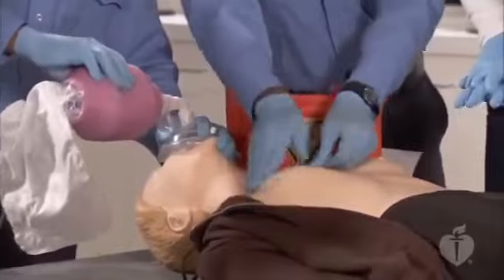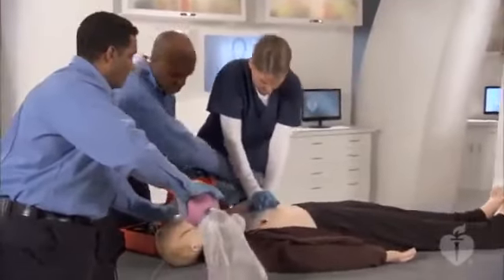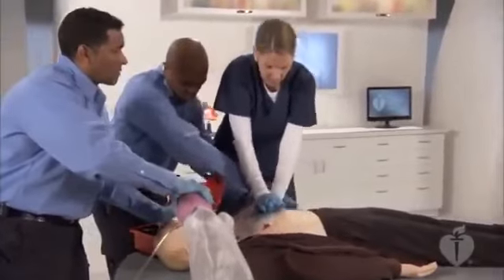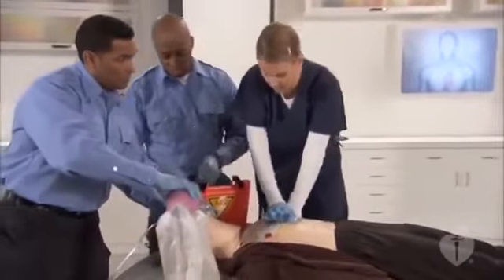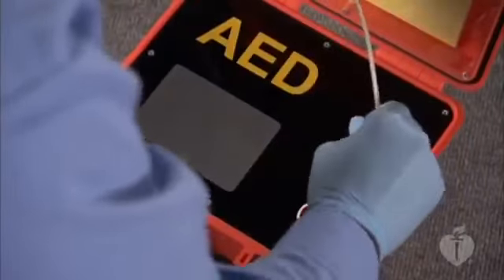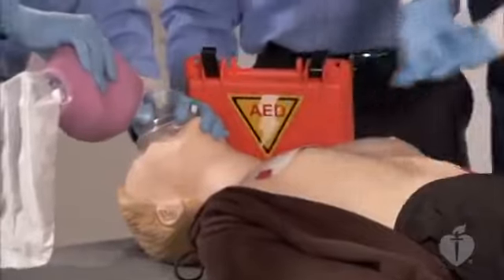Plug in pads connector. 1, 2, 3, 4, 5, 6, 7, 8, 9, 10, 11, 12, 13, 14, 15, 16, 17, 18, 19, 20, 21, 22, 23, 24. Analyzing heart rhythm. Do not touch the patient.